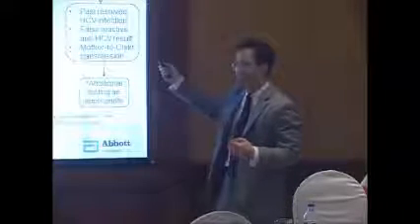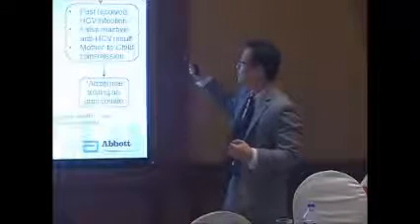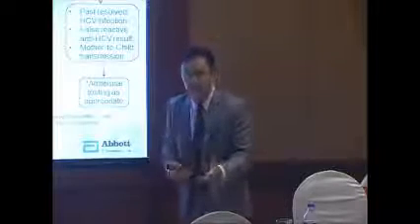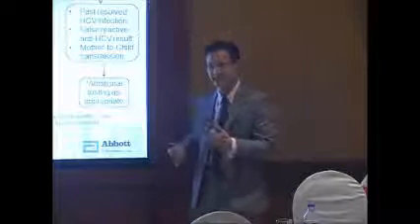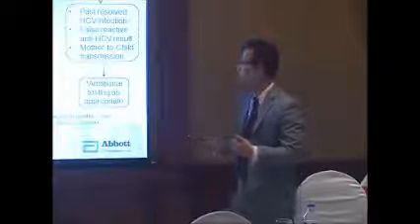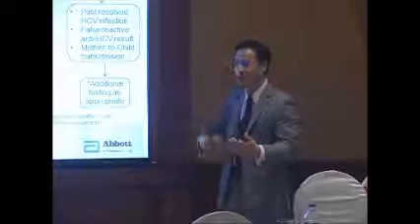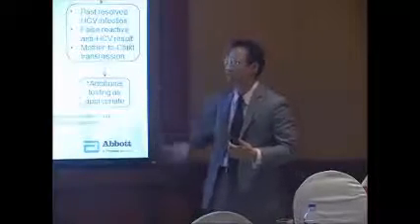And then if the antibody is reactive and the antigen is negative, then it can be a resolved HCV infection, because patients can be cured. Or it could be mother-to-child transmission, if it is that scenario. Or it could be a false reactive anti-HCV result. So we believe this algorithm, once our antigen assay becomes available, should be the one to follow.